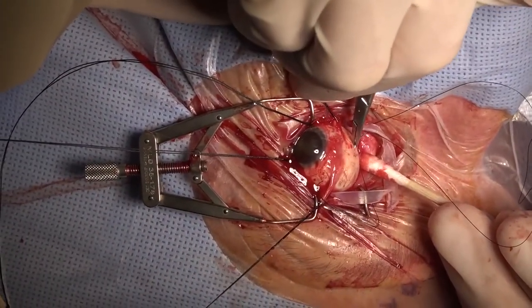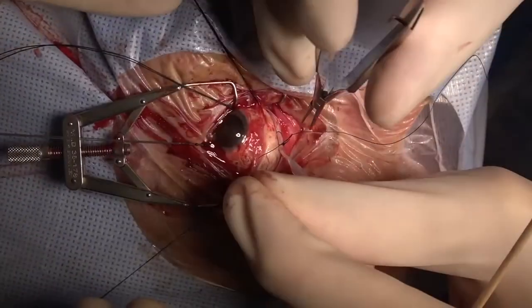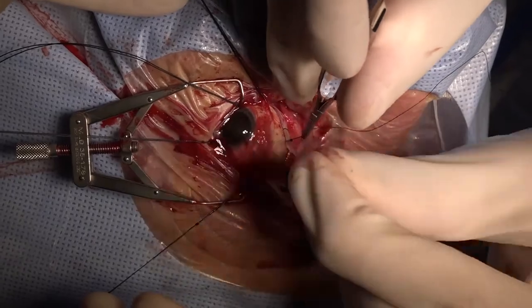The knots are rotated to the posterior aspect of the band in order to decrease the risk of eventual erosion. With sutures placed in each quadrant, this completes the scleral buckle portion of the case. The band will be tightened to the appropriate level. Thanks for your attention.